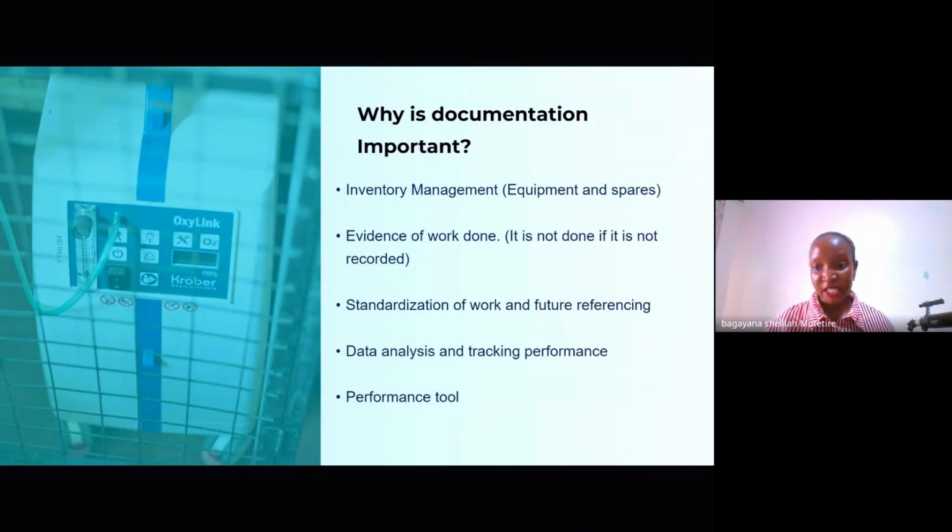And future referencing, say, what do our records look like? How many maintenances have we done? How are the equipment functioning? How long is the lifespan of the equipment we're working with? What are the current failures? At what hours do they normally occur?